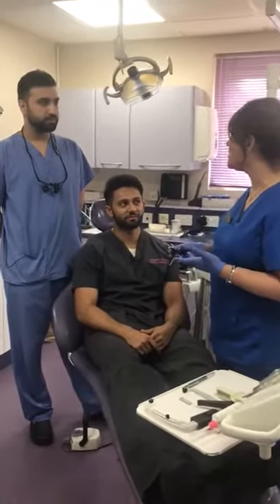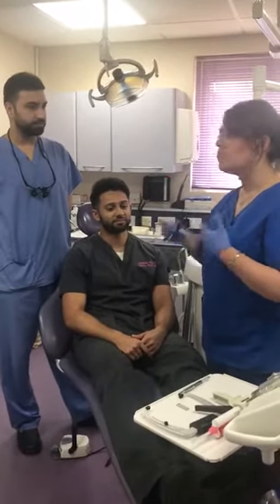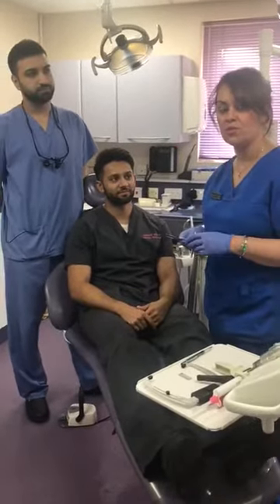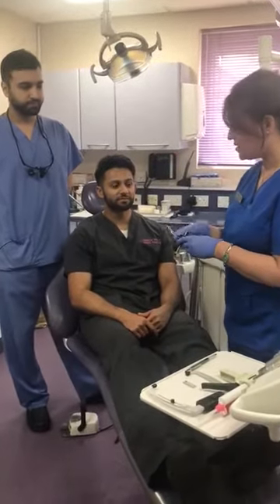For single units and normal day-to-day dentistry we really don't need it. When you have more complex dentistry and you need to check anterior guidances and lateral excursions, that's the time when you really need to use a face bow so you can relate all the information to the technician.